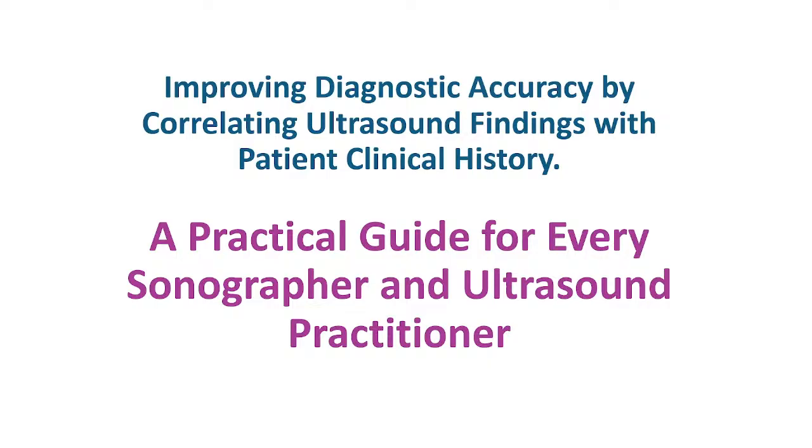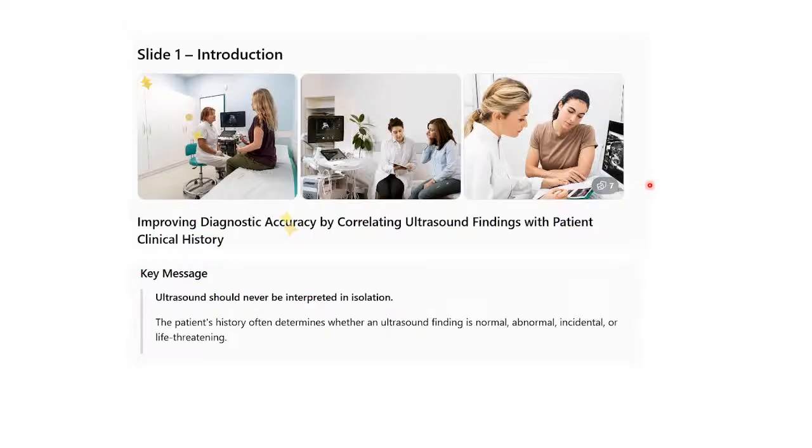Hello and welcome. Today let's talk about improving diagnosis accuracy by correlating ultrasound findings with patient clinical history. This is a practical guide for every sonographer and ultrasound practitioner. The key message: ultrasound should never be interpreted in isolation. The patient history often determines whether an ultrasound finding is normal, abnormal, incidental, or life-threatening.